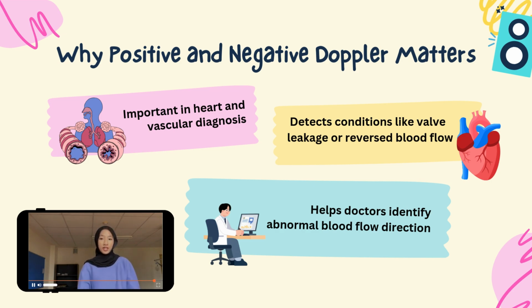This is especially important in heart and vascular diagnosis, where it can detect problems like valve leakage, narrow vessels, or reverse blood flow. Understanding these Doppler patterns allows doctors to make accurate diagnoses and choose the right treatment.